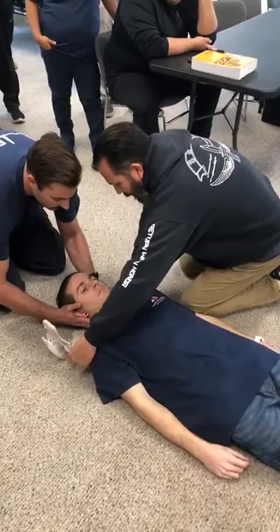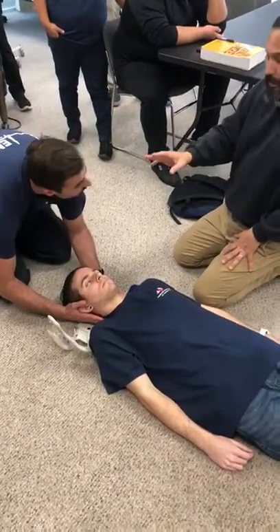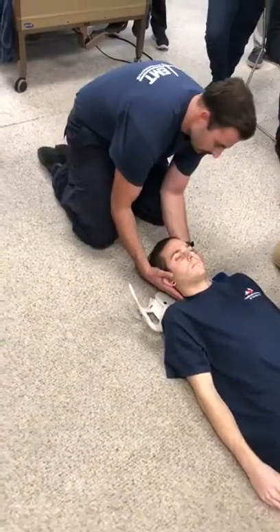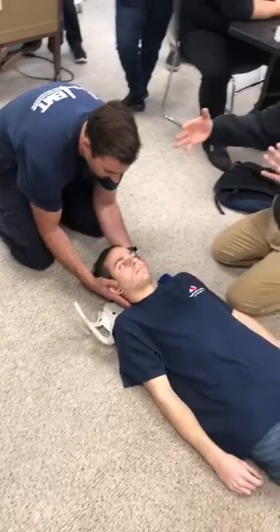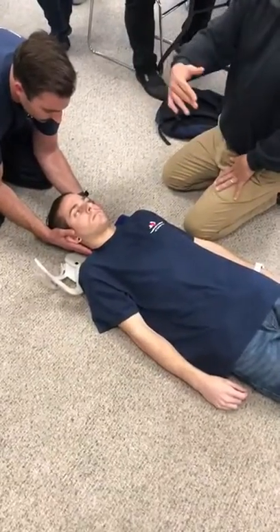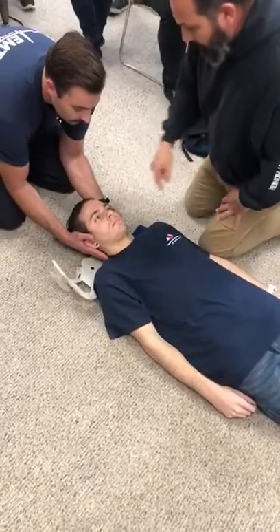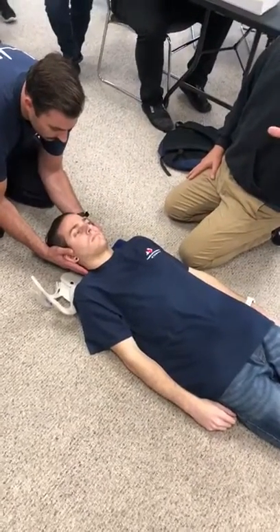Now we slide it underneath. That's the first move, and he's going to hold it there slightly elevated until I have the collar in position. I'm working with him — he has a better angle to see if it's midline. How does that look? Does it look like it's in the center? It does.